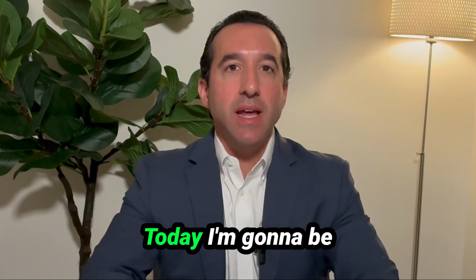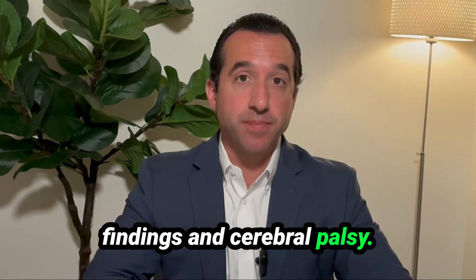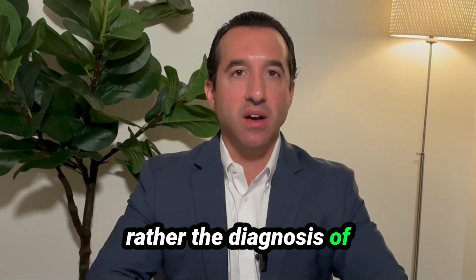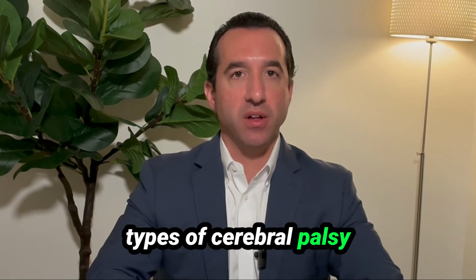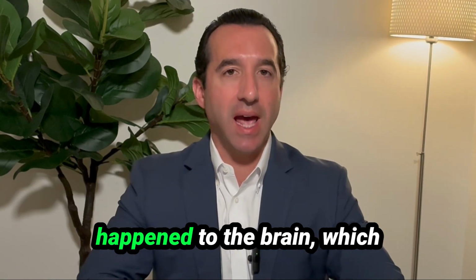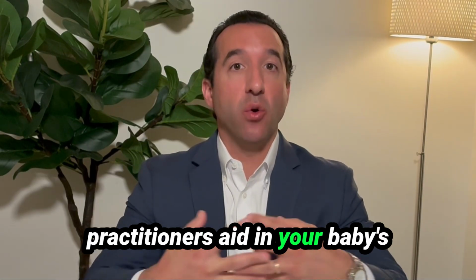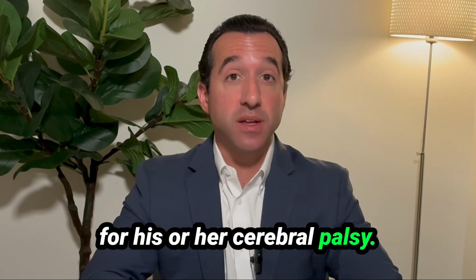Hi there. Today I'm going to be talking to you about MRI findings and cerebral palsy. Cerebral palsy is not necessarily the injury that has occurred, but rather the diagnosis of a movement disorder. There are various different types of cerebral palsy, and an MRI will show the practitioners what exactly happened to the brain which caused the cerebral palsy. That will help those practitioners aid in your baby's development and treatment for his or her cerebral palsy.